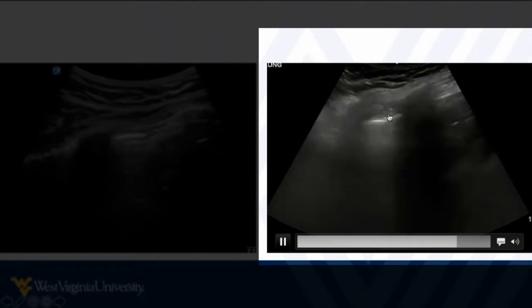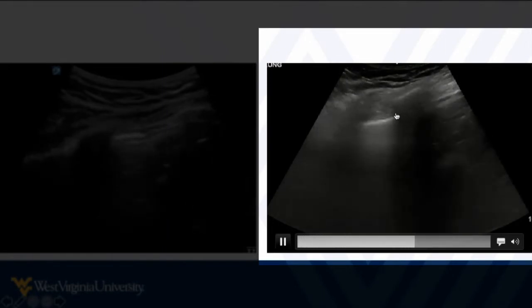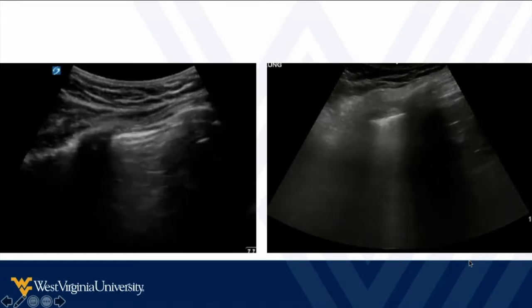Similar thing here, we're just getting close to the abdomen. So I believe we're catching, I don't know if it's liver or spleen, but we're catching another solid organ. So recognize where you are on the body. And because we see sliding here, it doesn't look the same over here, it looks different. But this is where we're just at the interface of abdominal organ and lung. So this may also mimic the appearance of a lung point. Don't let that fool you. Don't diagnose this as pneumothorax.